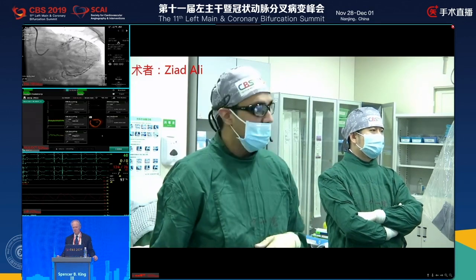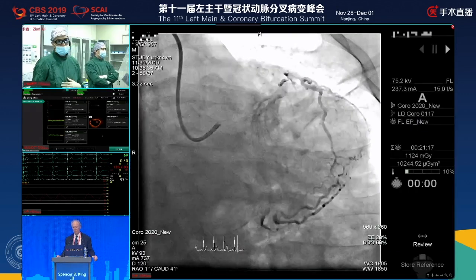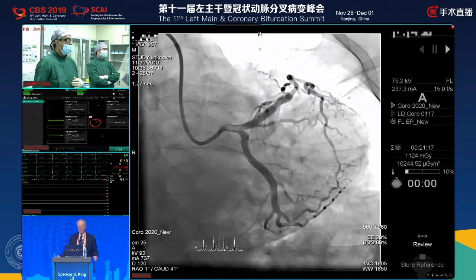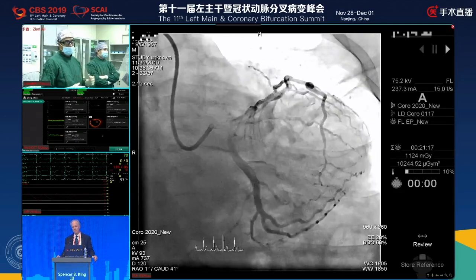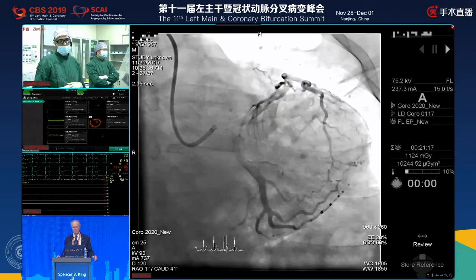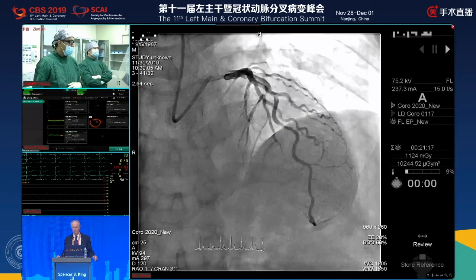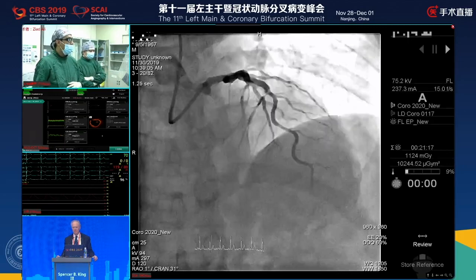So I'm just going to run through the angiogram with you, Spencer. The key to a good Angio-FFR is a non-panning, zoomed out lesion assessment of the coronary artery. So in order to get an accurate three-dimensional reconstruction, you need corresponding but contralateral views at least 30 degrees apart. So we started with an apicaudal. There's no lesion in the circumflex. You can see that same ambiguous appearing lesion in the LAD and a very tight lesion in the septal.